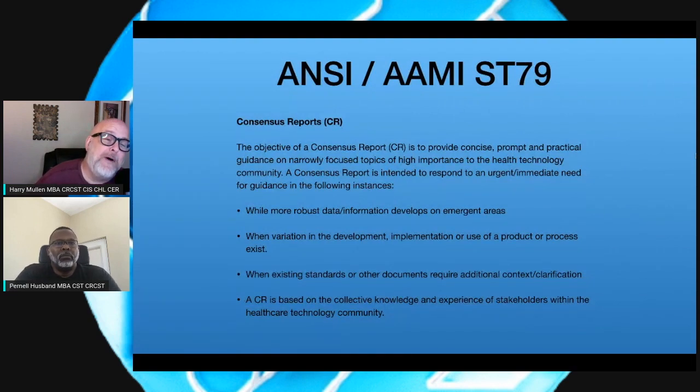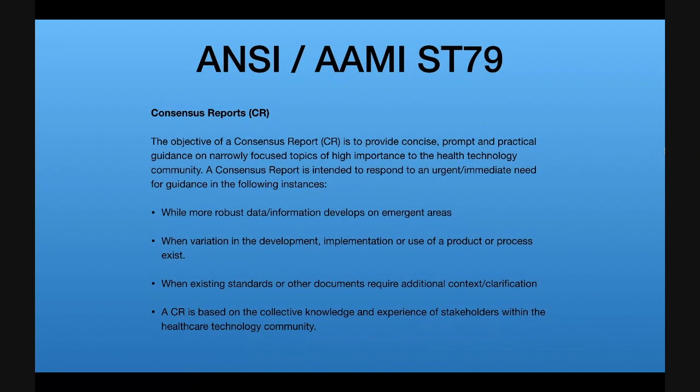So, Pernell, why don't you continue on and tell us about consensus reports? Absolutely. Consensus reports, or CRs. The objective of a consensus report is to provide concise, prompt, and practical guidance on narrowly focused topics of high importance to the health technology community. A consensus report is intended to respond to an urgent and immediate need for guidance in the following instances.